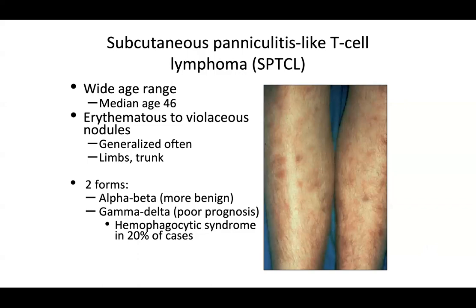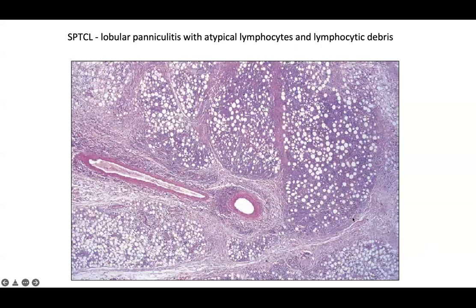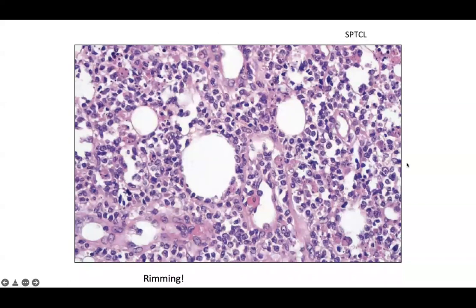From low power, you see what looks like a lobular paniculitis with lots of inflammation between individual adipocytes. However, these are atypical lymphocytes, and clonality testing would most likely return positive for T-cell clonality. Determining whether they predominantly express alpha-beta or gamma-delta TCRs is important for prognosis. On high power, you see individual adipocytes with cells in single-file rimming them — so-called rimming — though it can be difficult to tell if these are truly atypical or clonal without immunohistochemistry and molecular testing.